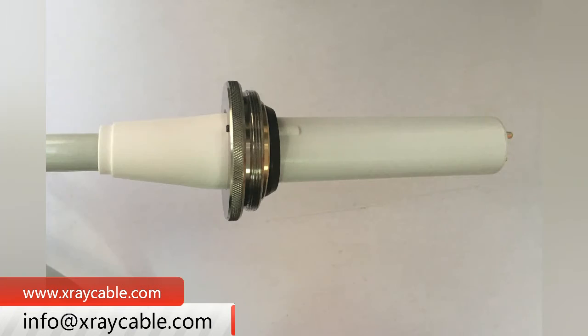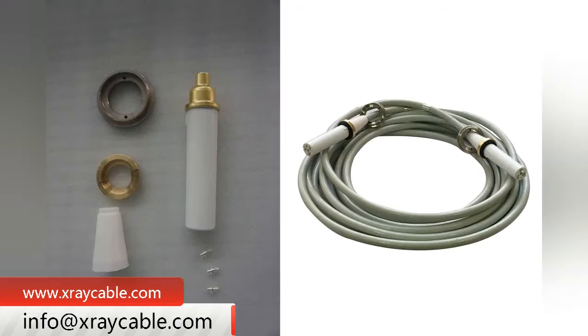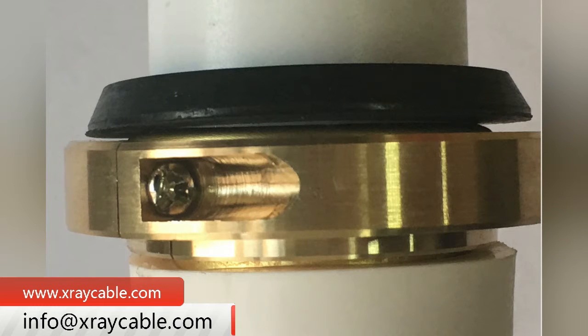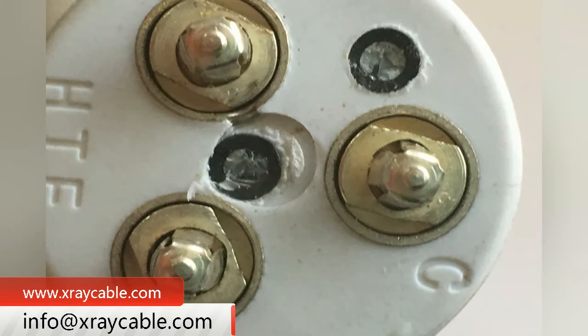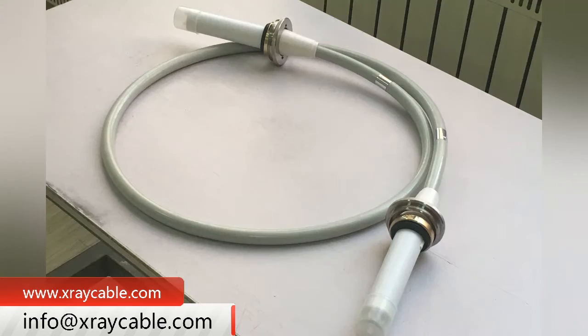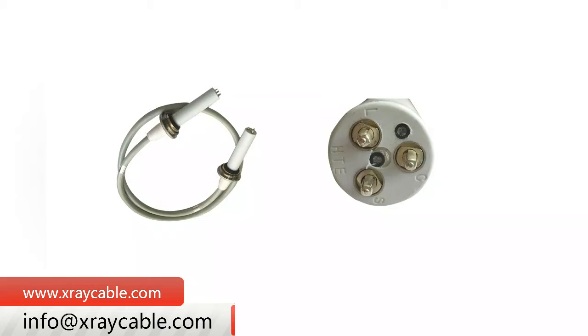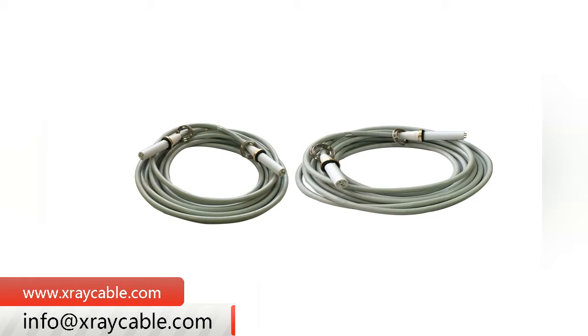The 8M75 KV is the maximum voltage rating of the 8M75 KV High Voltage Cable. Two of these cables on an X-ray Machine can withstand 125 KV of high voltage. The length is medium and suitable, and Nuhig High Voltage Cable lengths can be chosen between 2 and 20 meters.